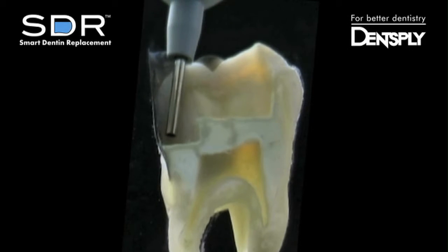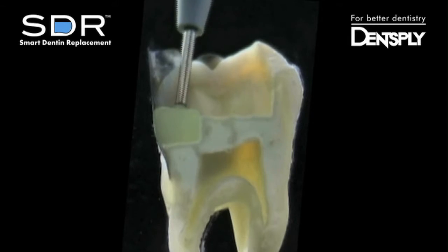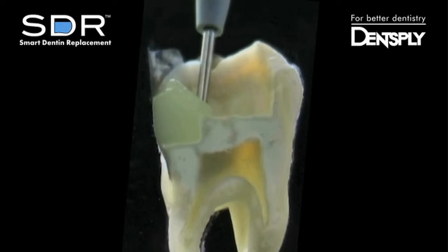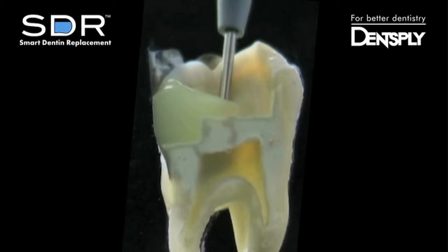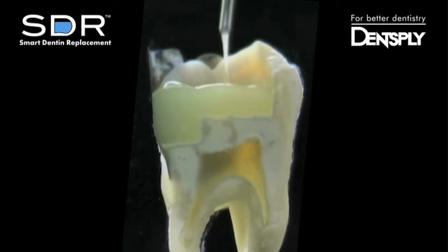Begin dispensing at the deepest part of the proximal box. SDR not only adapts to the matrix band, but to the internal anatomy including the sharp corner of the proximal box. As we move across the prep, the material is not pulling or dragging, but moving along with the cannula tip. After placing the material up to 4 mm, it quickly levels to provide a smooth interface to adapt composite to.